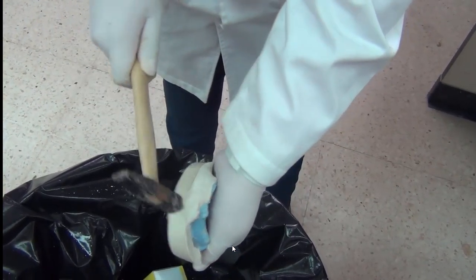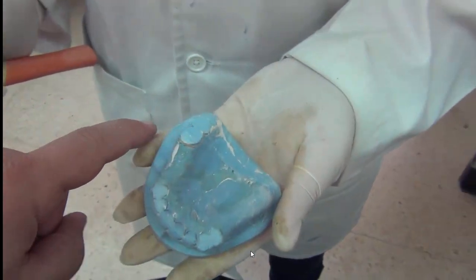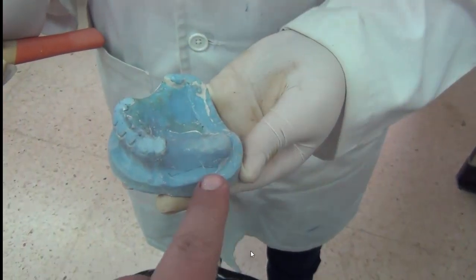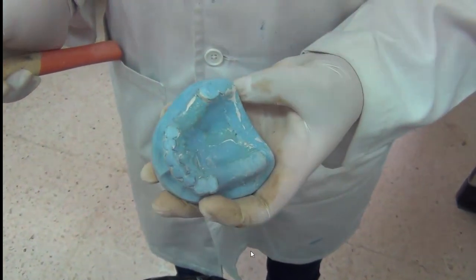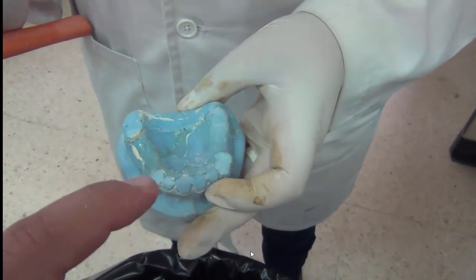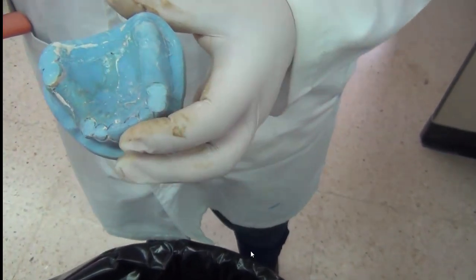Okay, so we try to control our forces on the plaster by hitting on the edges more. How do we control? Once more, by hitting the plaster on the edges around the cast. And at all times you found that the technician was holding the cast very firm in her hand while knocking on the edges. This will support the cast so it does not fracture. And as you can see, now we have the full cast with us. This can help us judge our complete denture in terms of extensions, in terms of any need for finishing the edges, and this will help us in the procedure of the finishing of the denture.